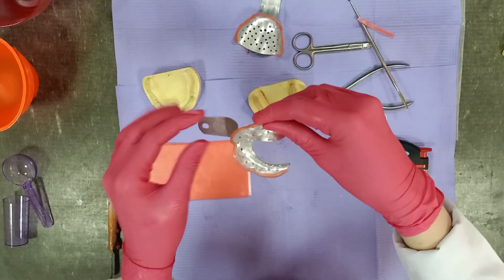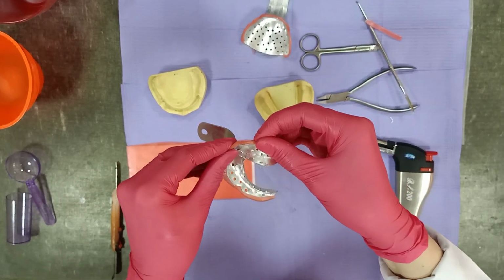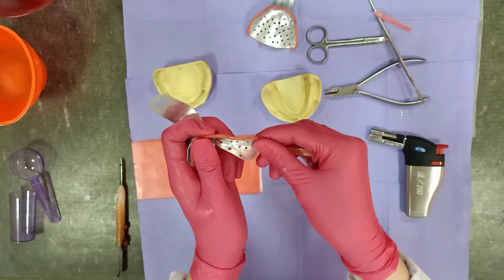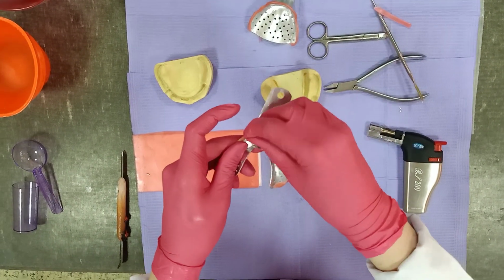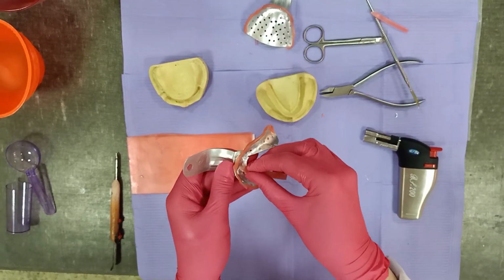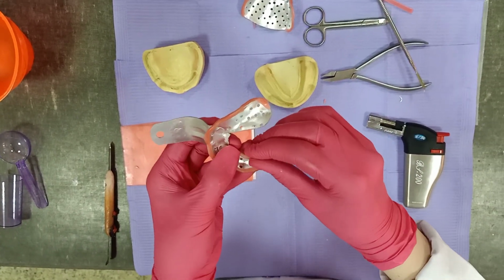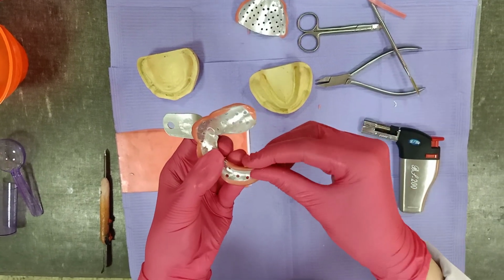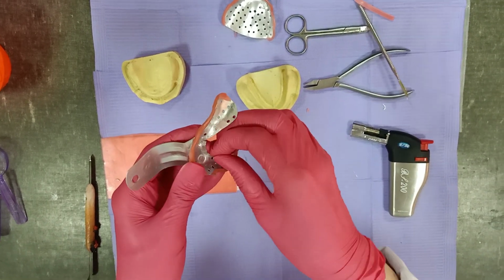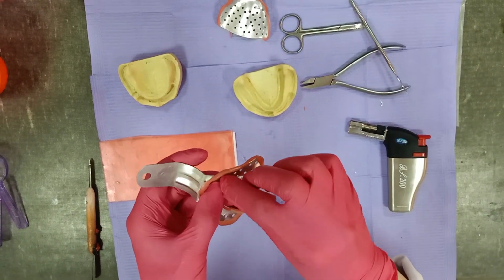Now you are sure that your tray borders are all smooth, ready for taking the primary impression in the patient's mouth, performing all border molding and avoiding any injury to the patient's mucosa. Don't forget the lingual side of the tray in the lower, all frenal area and all the borders should be covered with wax to avoid any injury to the patient's mucosa.